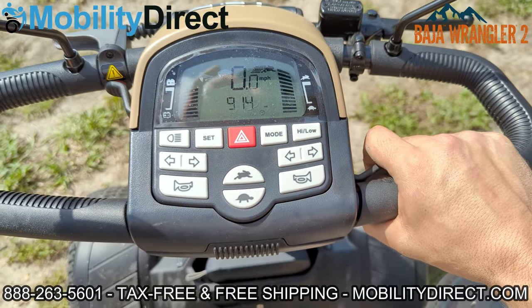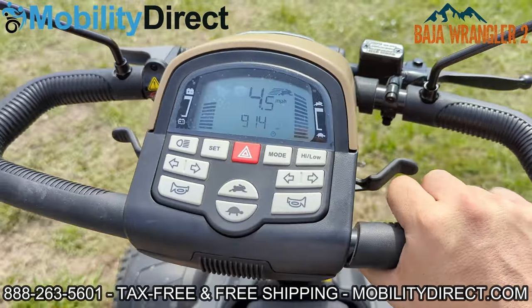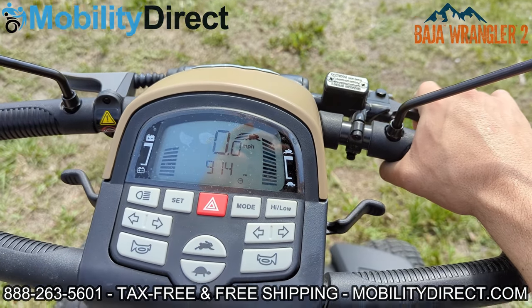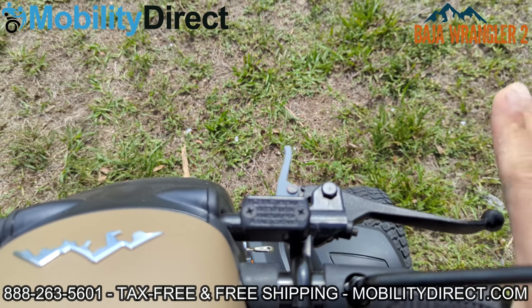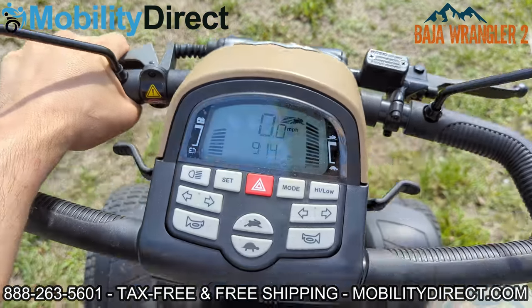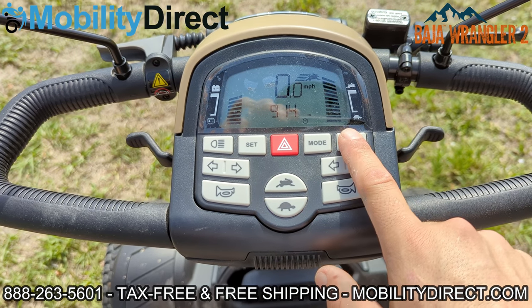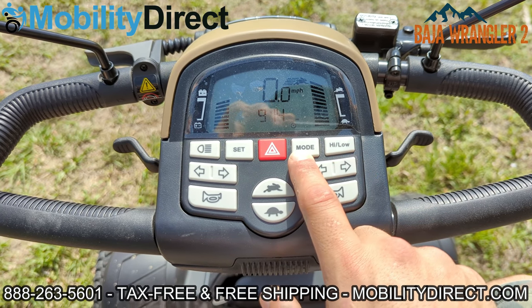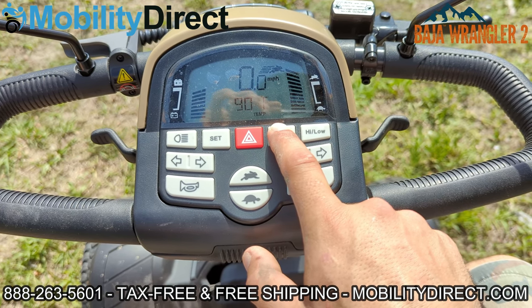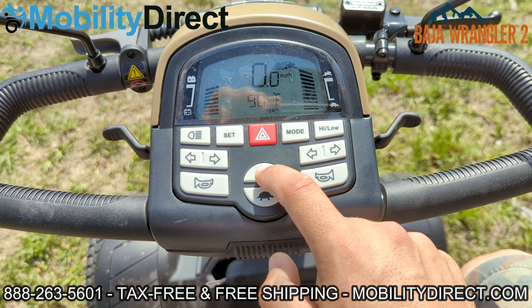I've just got on. Here's the handlebar — delta tiller, wraparound, very safe. I'm going to ride this thing full speed with one hand. You can go forward and backward with the trigger: pull back and it goes forward, push forward and the machine goes backward. It has a handbrake you can lock if you're on an incline, but it has automatic brakes so it's really not necessary. You can also adjust the tilt by using this lever — bringing it closer or further away from you, the tiller assembly. There's a really loud horn, turn signals, high and low speed mode which limits your speed halfway. The mode button changes the display from odometer to trip to temperature. You also have the light switch and you can set the time with the set button. This controls speed increase and decrease.